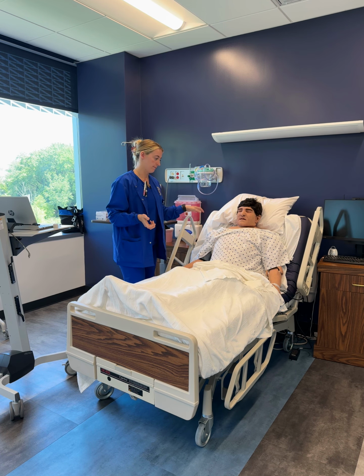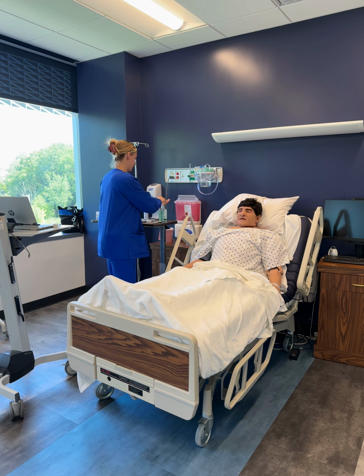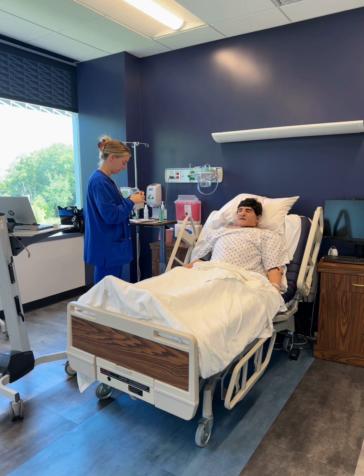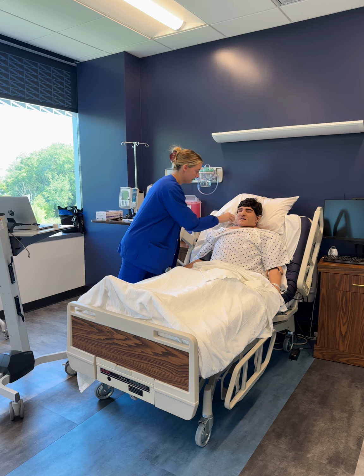Now we're going to raise the patient into a 90-degree angle for the insertion of the NG tube. I'm going to perform hand hygiene. I'm going to prepare my tape, making sure the pieces are 3 inches. I'm going to do 3 pieces on a clean, sanitized surface, making 1 split halfway down the middle. I am going to check the patient's gag reflex.